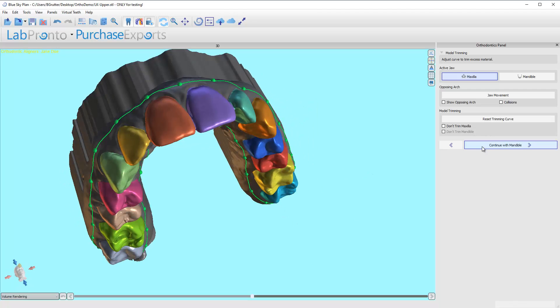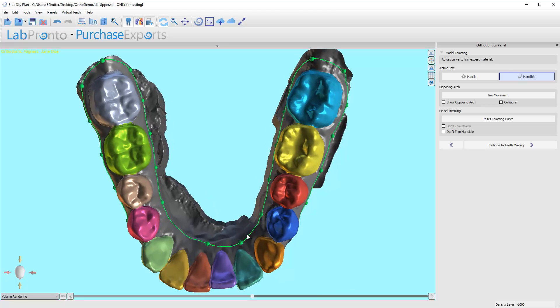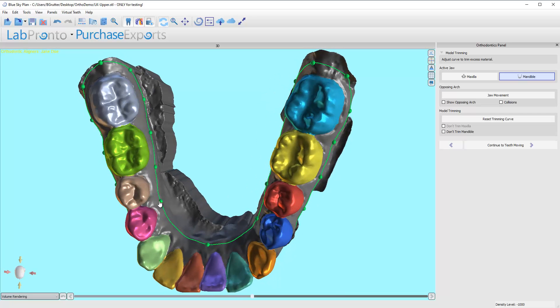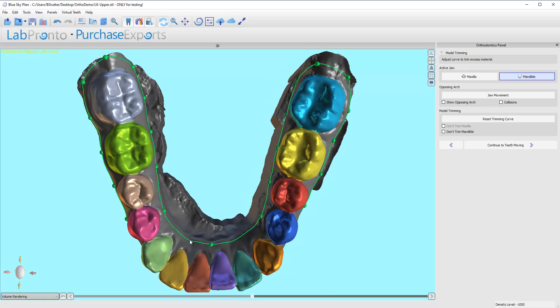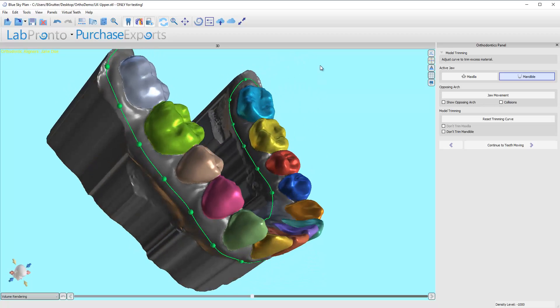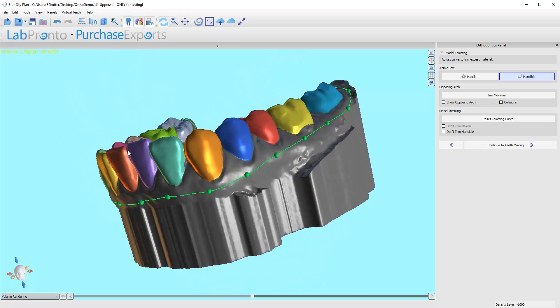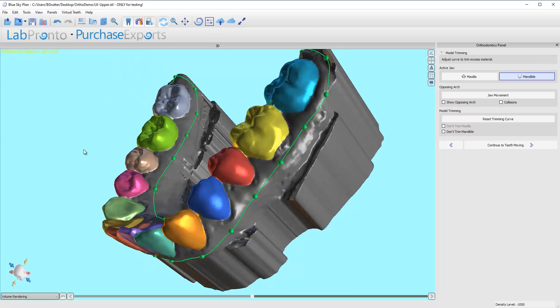Let's go to the mandible. Once again I'm going to right-click, right-click, move this to the midline, and then make sure I've got one node on either first premolar. That gives a nice gradual arc shape there. Looking at the other nodes — making sure it's not too bad anywhere else — looks pretty good.